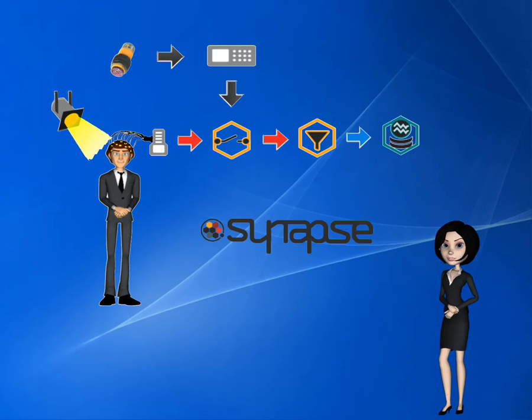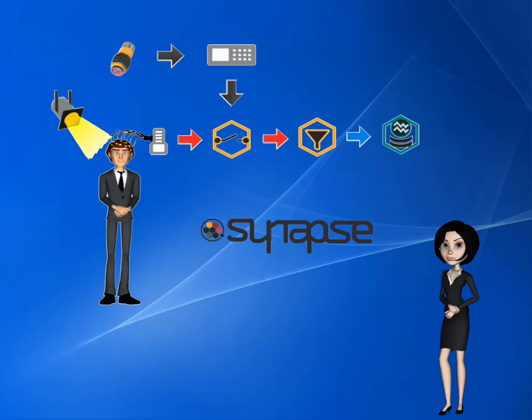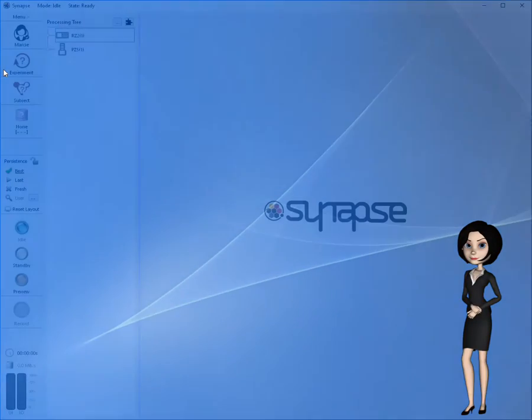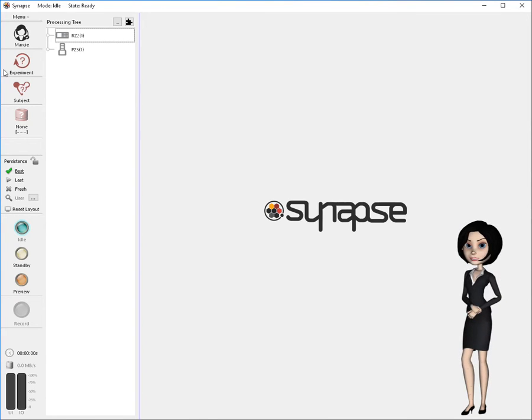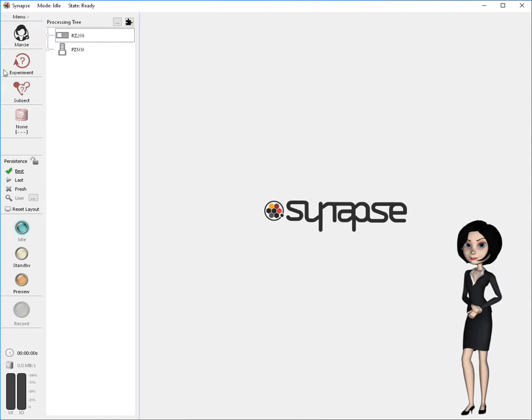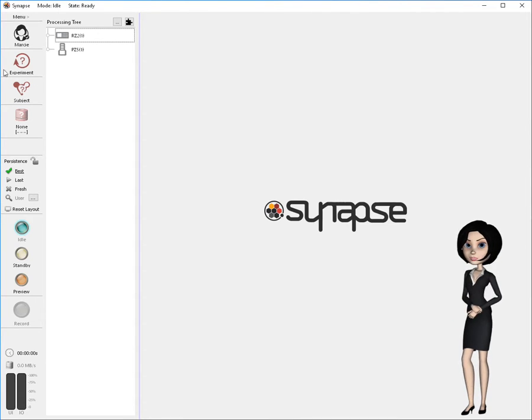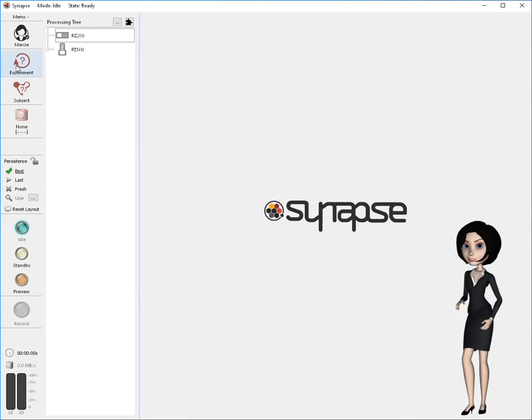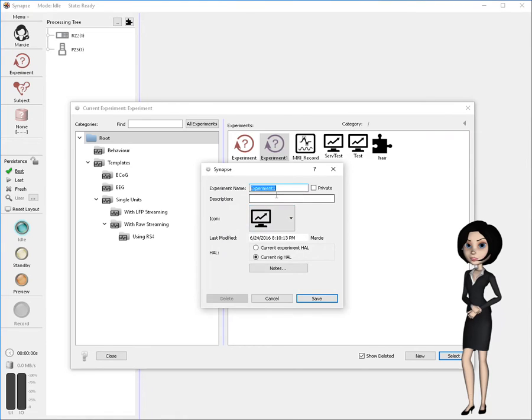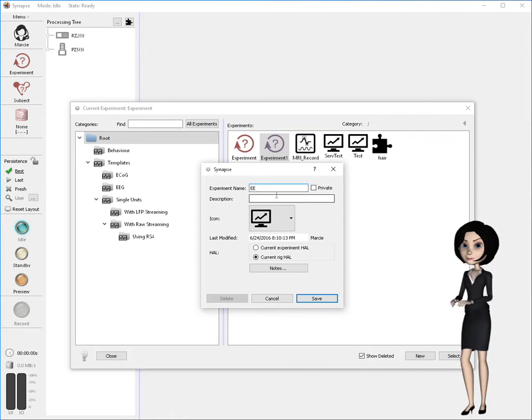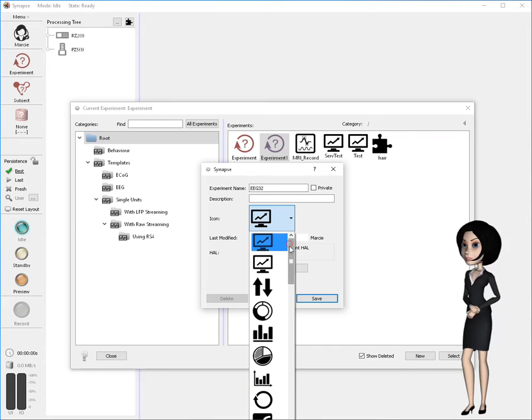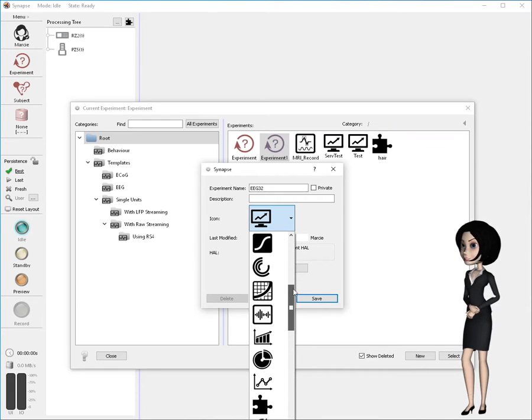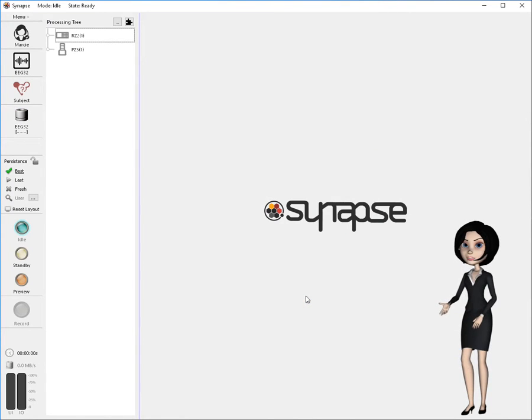I will first build and run the experiment without the artifact blocking. Then I will show you just how easy it is to make changes to your experiment in Synapse by adding and connecting these elements. We start here in the idle or edit screen in Synapse. I've already made myself the current user. So now I need to create a new experiment and subject. Both of these tasks are accomplished using just a few mouse clicks via the control bar buttons. Simply click experiment and choose new. When the dialog appears, type a name for your experiment and select an icon. Choose one that will help you identify the experiment at a glance when it's selected in the future. Click save and a new blank experiment will be created, ready for you to edit.